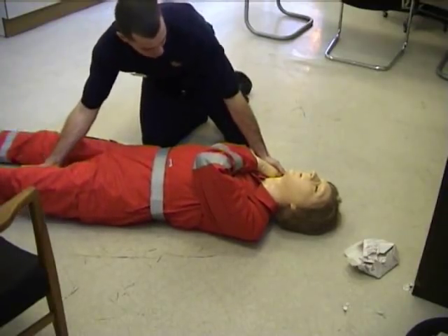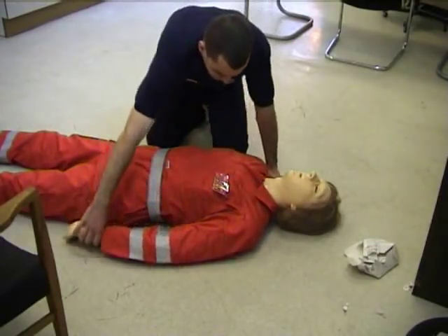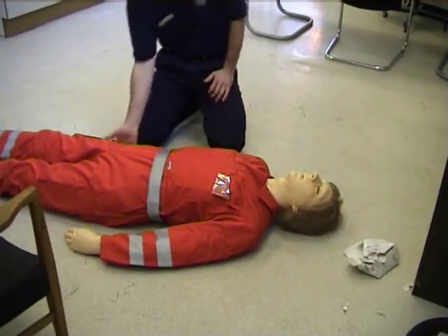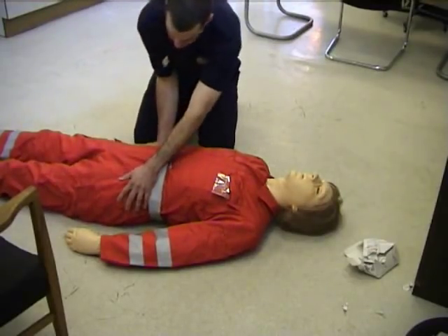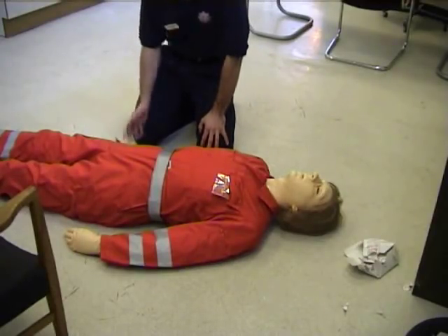Hang on, rest. Just think about what you're doing. Ok. Before you roll the dummy over, what are you going to do? Check pockets.